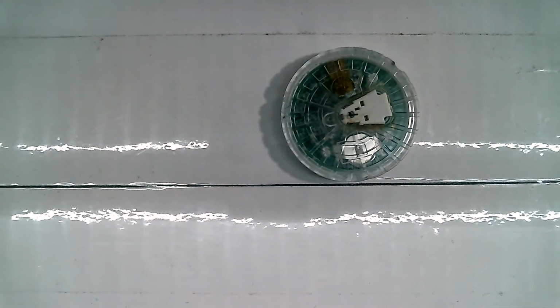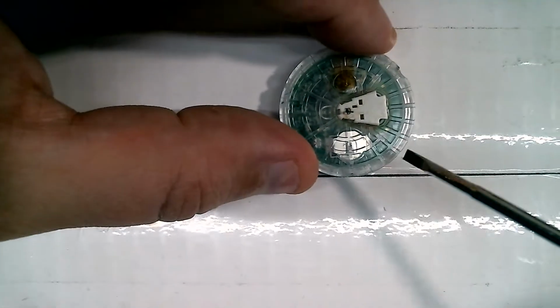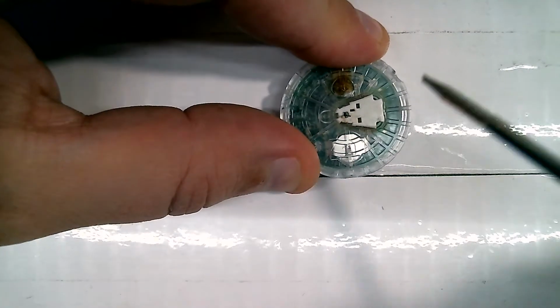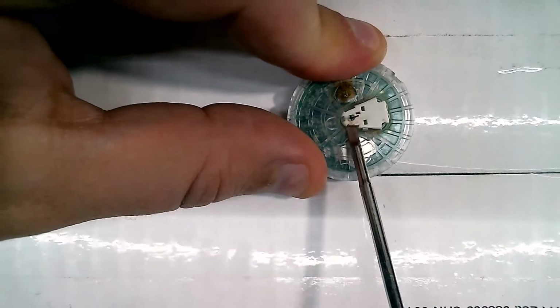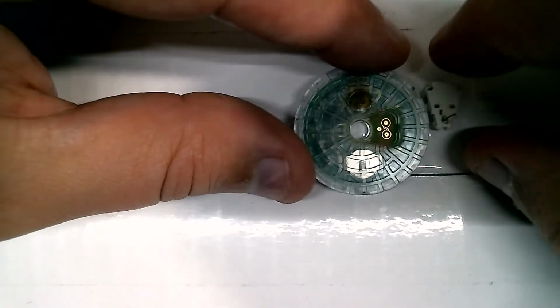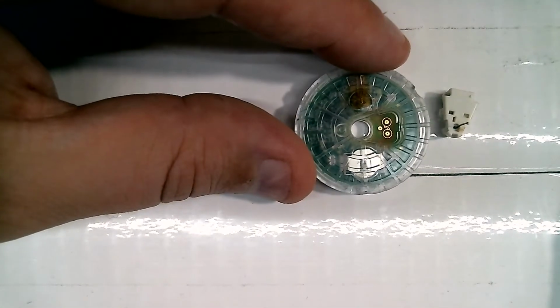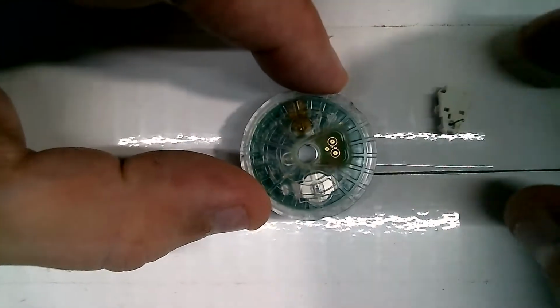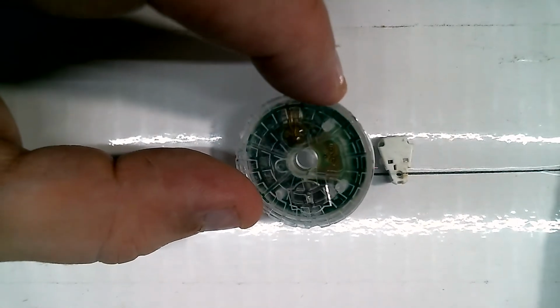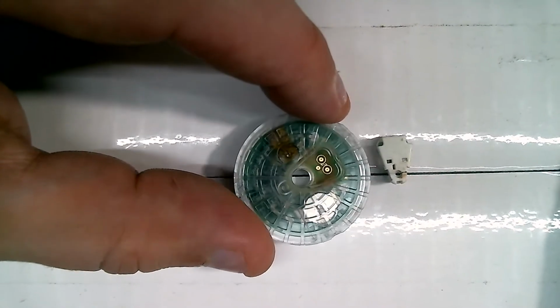Let's try to get the sensor first. Let's see here. So it looks to be this portion right here, which is like a soft area. Let's try to pull that out first. Oh, hey, there we go. All right. So that wasn't too hard. Okay, so that is the actual sensor piece. Got it. So that's what's doing the actual sensing. The rest of this is just the board. Okay, excellent.